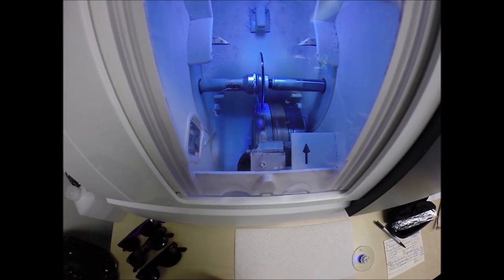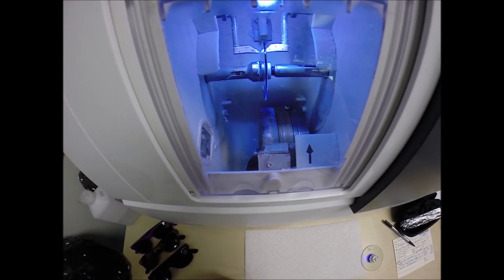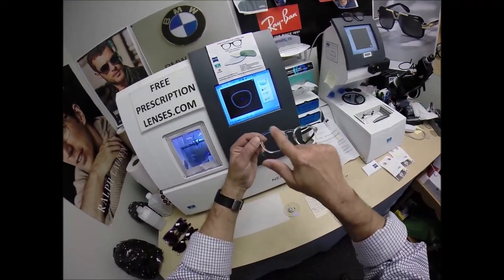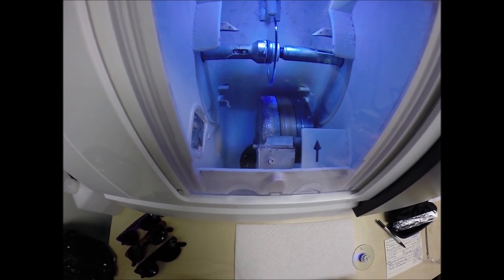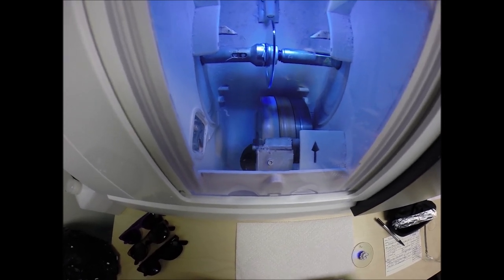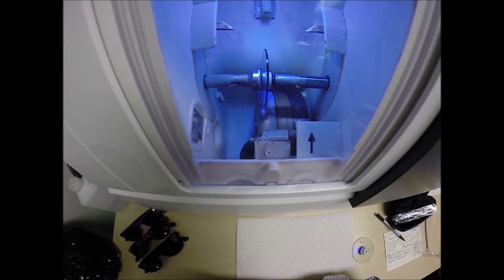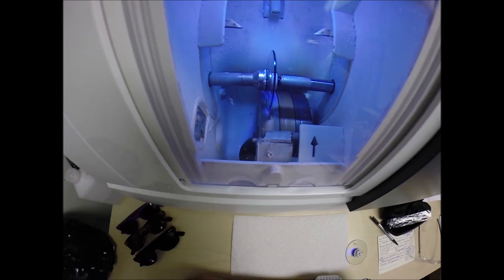The lens is going to be traced by the two white styluses, making sure that it's large enough to fit into the frame first go round. And you can see as it's tracing the shape of the right side of the frame. And then this old carpenter saying, measure twice, cut once, is measuring the thickness of the lens at every point to know where to place the bevel. So you have the least amount of edge thickness showing, of which, Robert, you will have none. Based on your prescription in this frame, you will have no edge thickness.